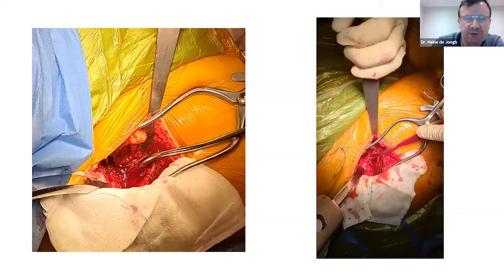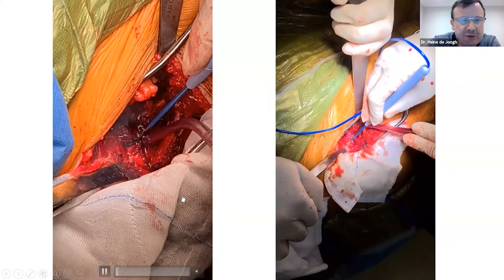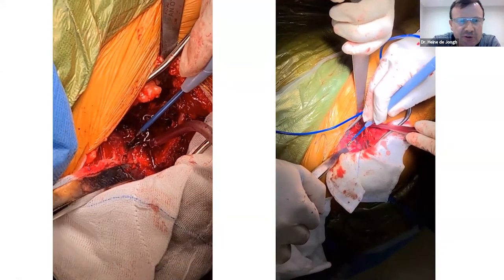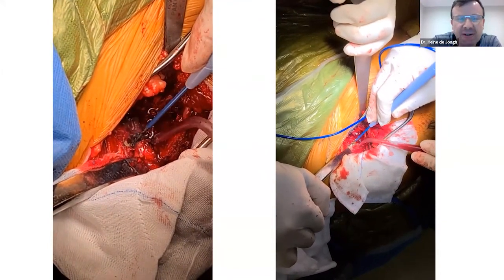So let's focus on the elevation. Two techniques well known. So they use the dislocation hook to just hook it in underneath the medial calcar, but I rather just use my normal Homan gently underneath the capsule there. So this, I hope the videos. This is two examples of me doing the superior capsulotomy.